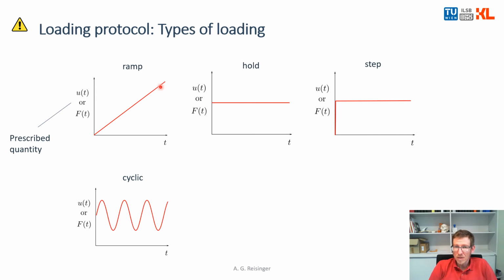And the question can be asked, how many load cycles can the sample take? How many load cycles can the implant take until fracture? And therefore you need to apply a cyclic load case, right? To simulate those steps, this walking, this gait of the patient. Yeah, so you have a sinusoidal load application. Again, either in displacement or in force.